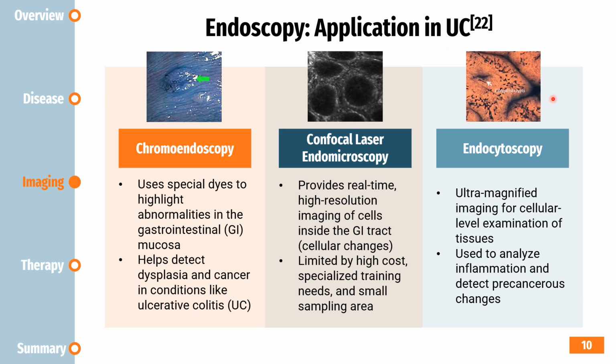Last is endocytoscopy. This method provides extremely magnified images of tissues, allowing doctors to examine cells in great detail. It is used to study inflammation and identify precancerous changes in the digestive tract, offering a closer look at tissue health than the standard methods.